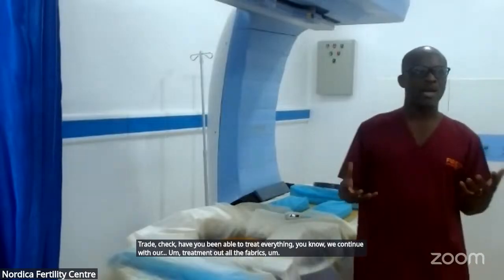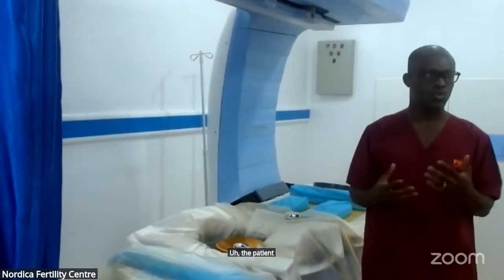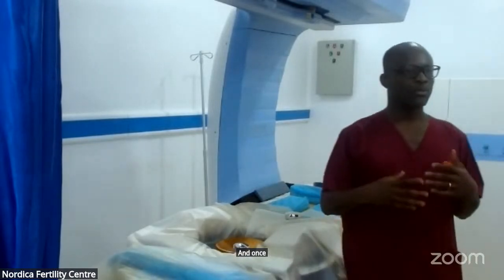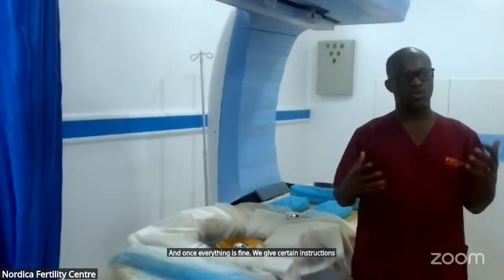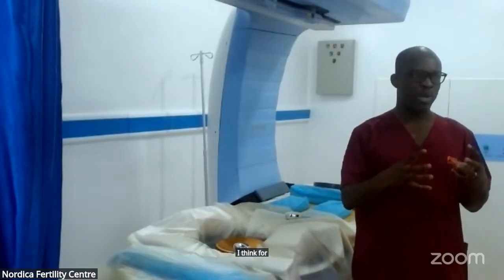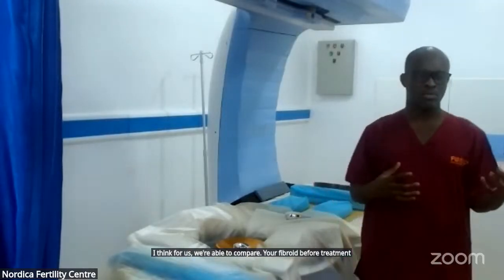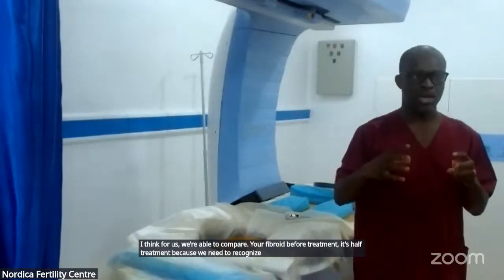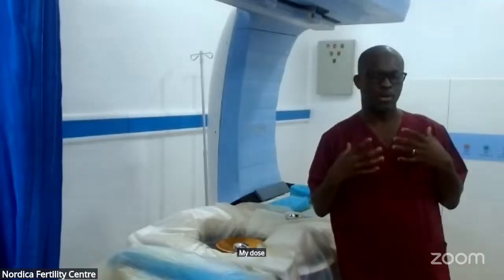After the HIFU treatment, the patient rests for 2 hours while we check the vital signs. Once everything is fine, we give certain instructions, and then we ask the patient to do a post-treatment MRI so we can compare the fibroid before and after treatment. We need the client to see the difference, to be sure that we've really done something, not just based on our own assumption.